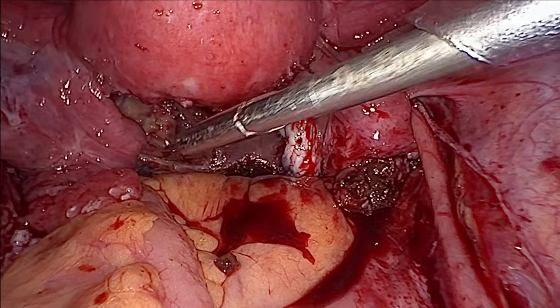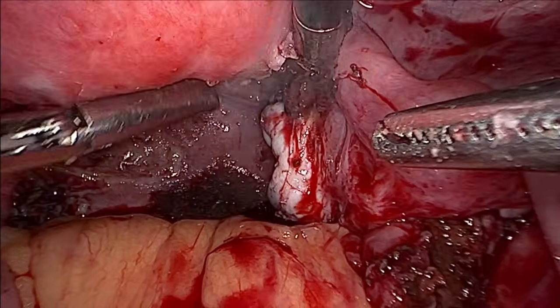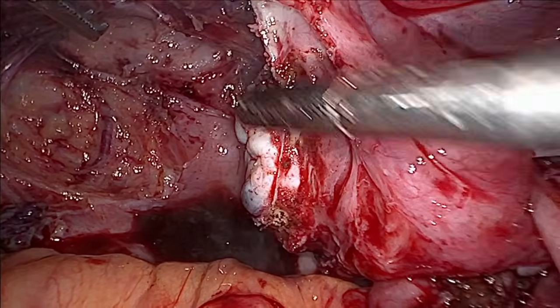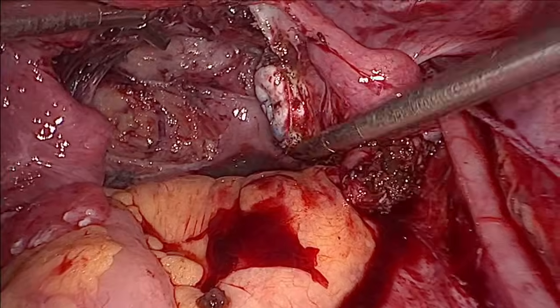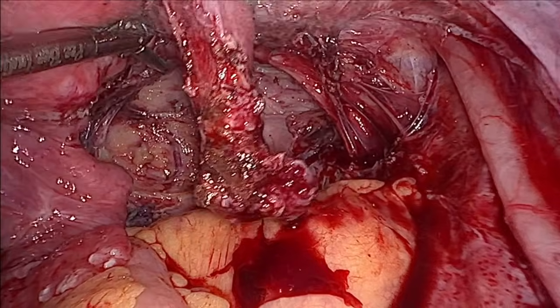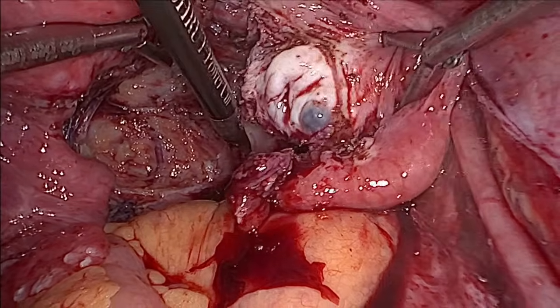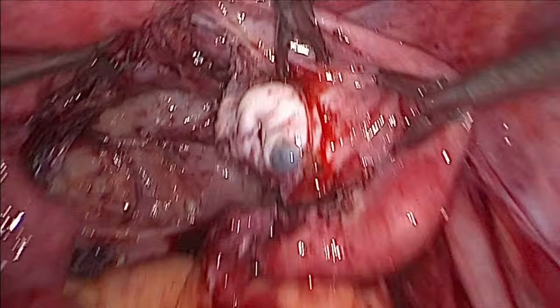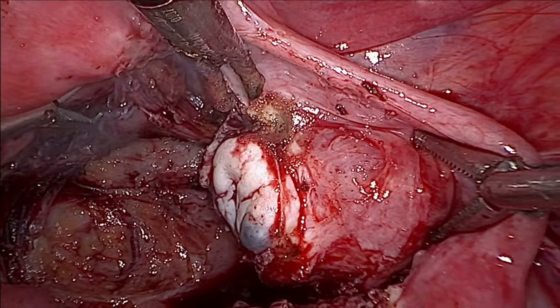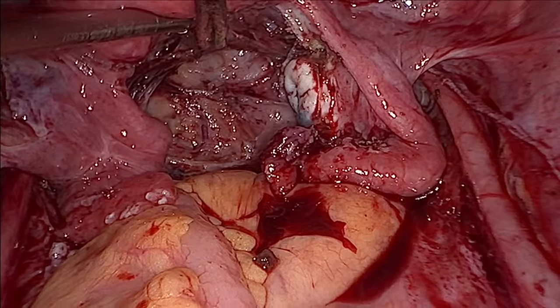There's some bleeding there, actually it's from where I had held the ovary. It's okay. Suction, I will take the suction.